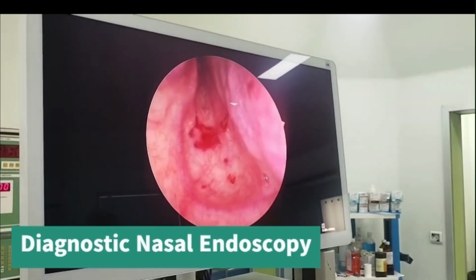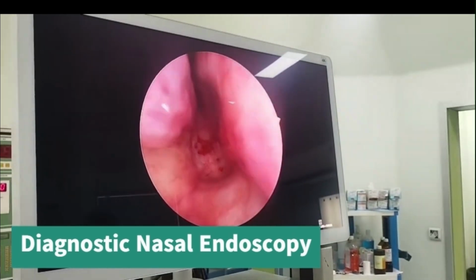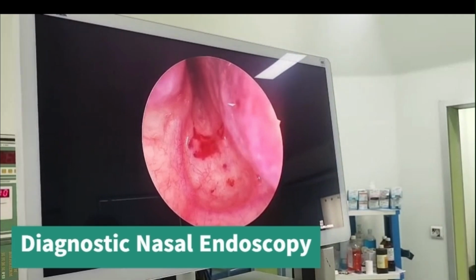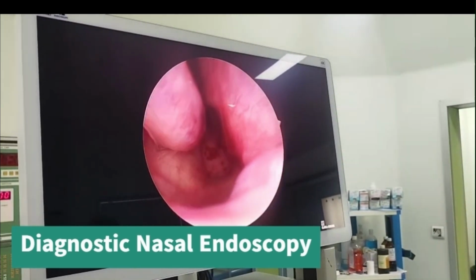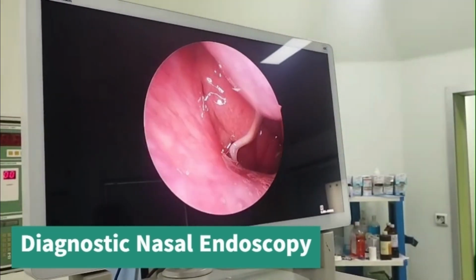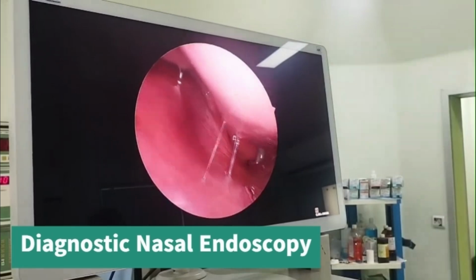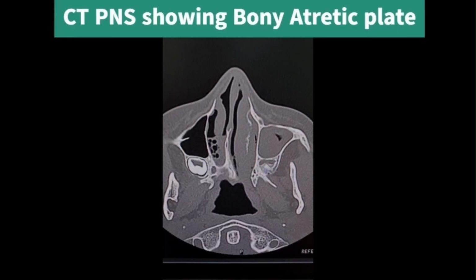So this was the picture which I saw on diagnostic nasal endoscopy. You can see the atretic part of the choana. The atretic part was mixed. That is, this choanal atresia was a mixed type with both bony and membranous. In the left nasal cavity, we can see that the nasopharynx is patent, and I can see the hypertrophied adenoid.